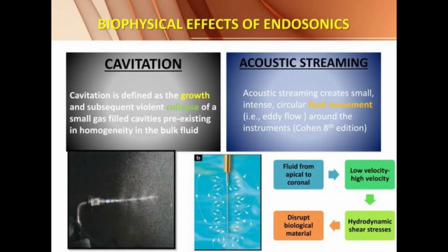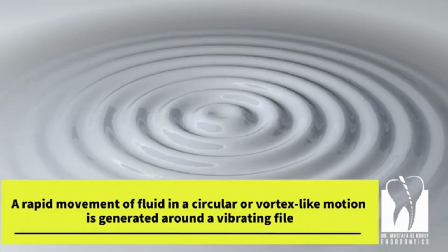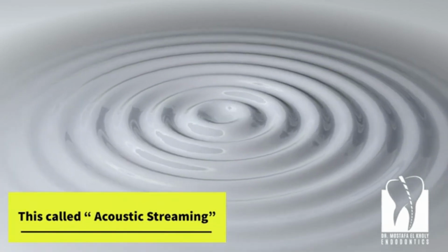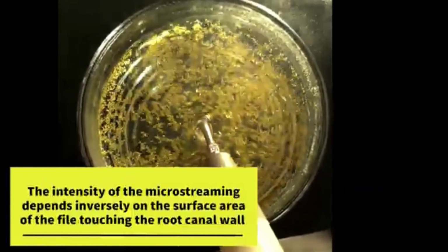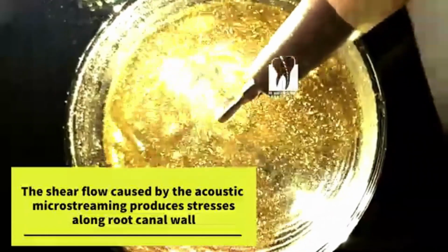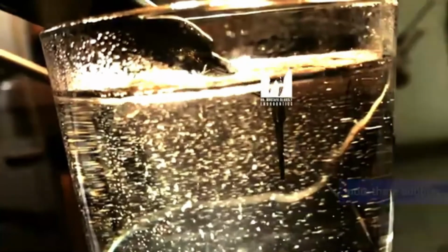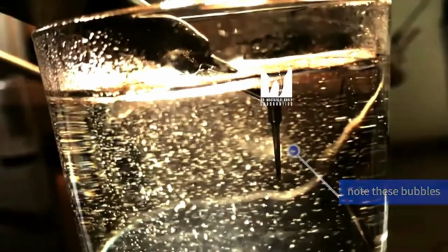What is cavitation? Cavitation is defined as growth and subsequent violent collapse of small gas-filled cavities pre-existing in inhomogeneities in the bulk fluid. So you will see creation of steam bubbles or expansion, contraction and distortion of pre-existing bubbles in a liquid. That is cavitation. Next is acoustic streaming. Acoustic streaming will create small intense circular fluid movement around the instrument. That is the generation of time-independent, steady, unidirectional circulation of the fluid, which results in production of large hydrodynamic shear stress around the file.